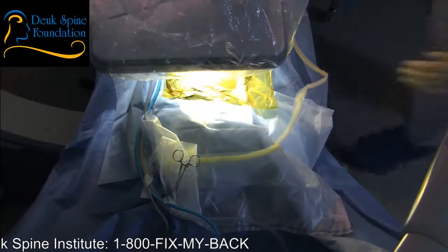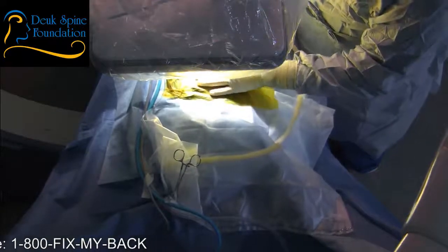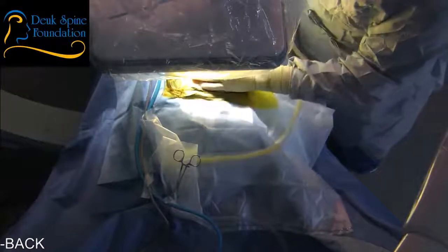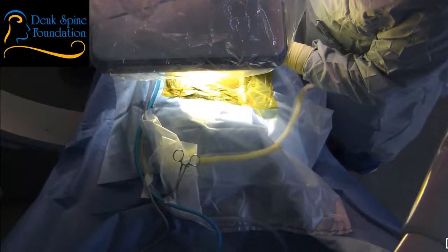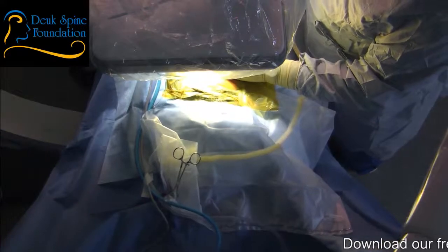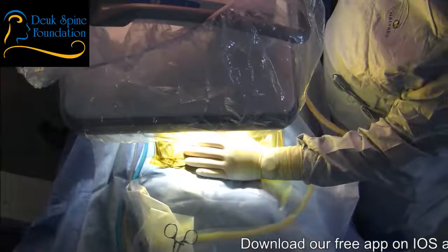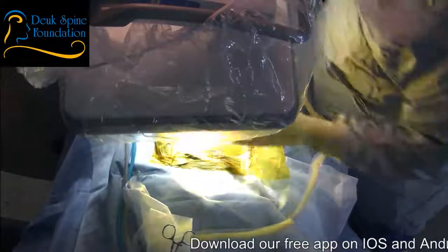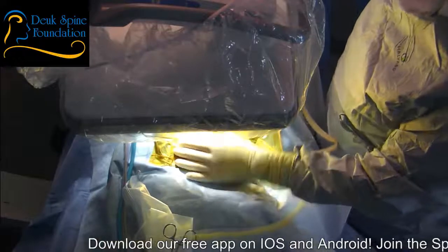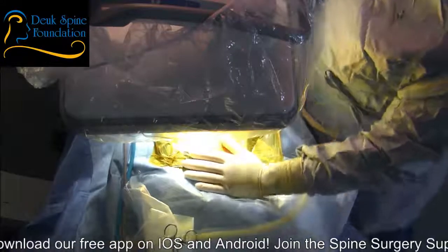Sir, are you ready to get started? Dr. Deukmedjian here, okay? I'm going to be talking to you and some people as well, the audience that are watching and my team. Are you comfortable where you are? Understood. We're going to get rid of that for you, but I need you to lay still during the surgery, okay? If you feel anything that hurts, don't try to move. Just say ouch and I'll give you some more pain medicine. Deal? All right. We're going to get started.